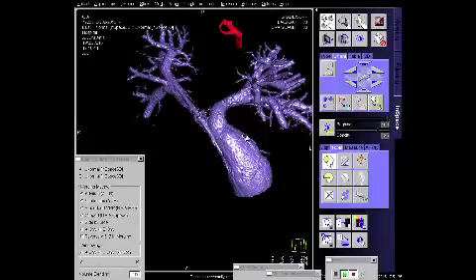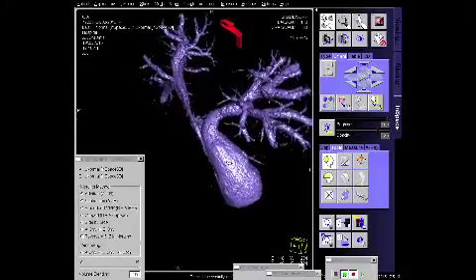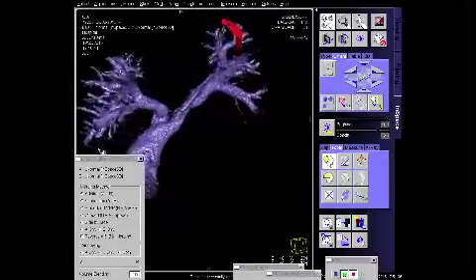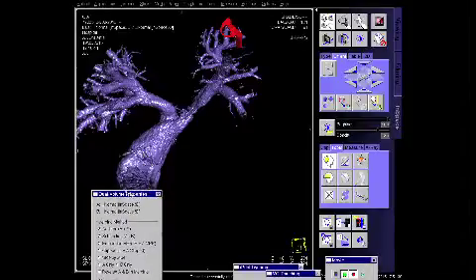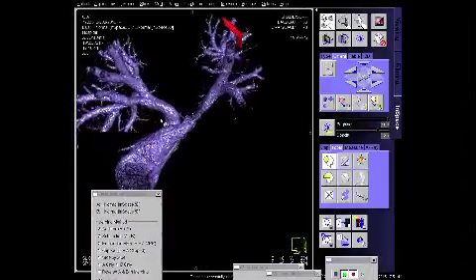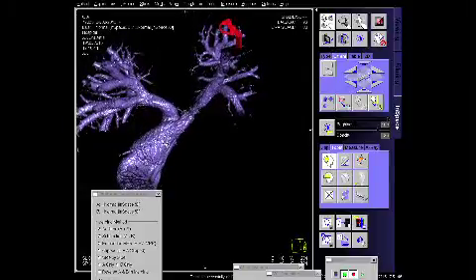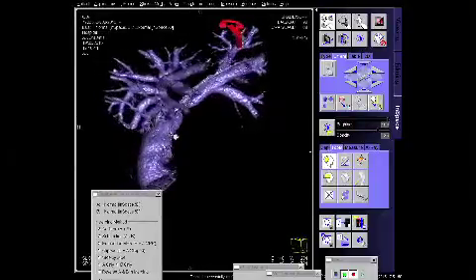On the left side we see this tortuous LPA, and we measured on both sides, and Gianfranco, I think, made up his plan for how to treat this bifurcation situation. Last comment: we will use this PA topography now to find the best angulation, or verify the best angulation he was already choosing by conventional angiography. Any comment from the audience, from the panel?